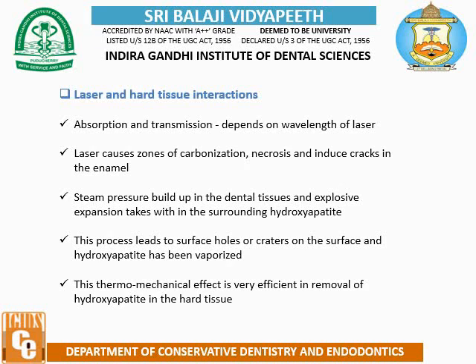Steam pressure buildup in the dental tissues and explosive expansion take place within the surrounding hydroxyapatite. This process leads to surface holes or craters on the surface, and hydroxyapatite has been vaporized. This thermomechanical effect is very efficient in removal of hydroxyapatite in the hard tissue.